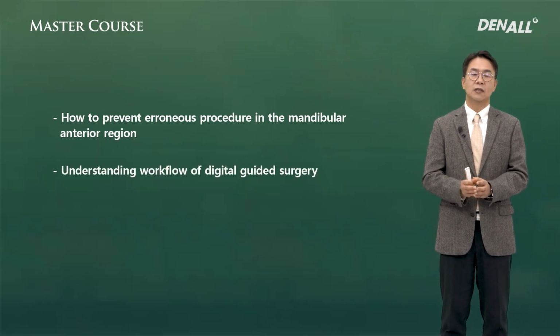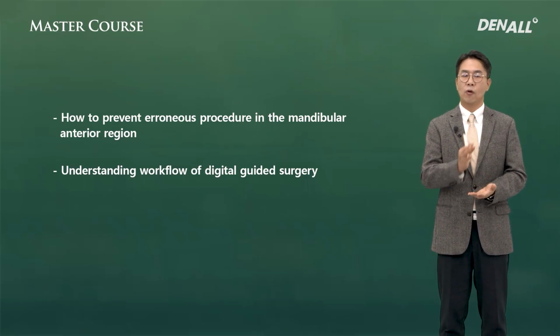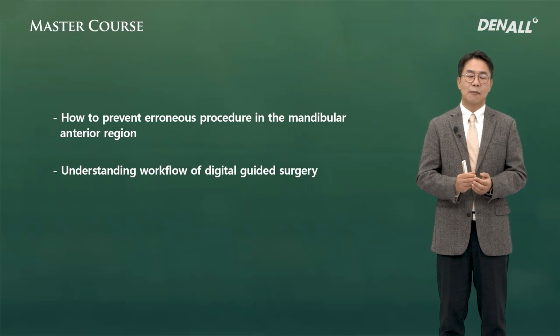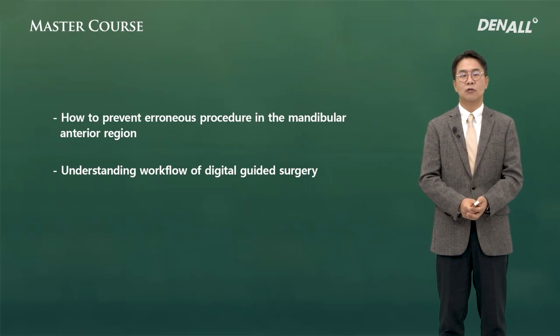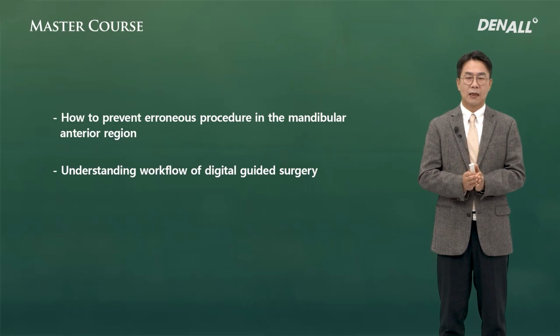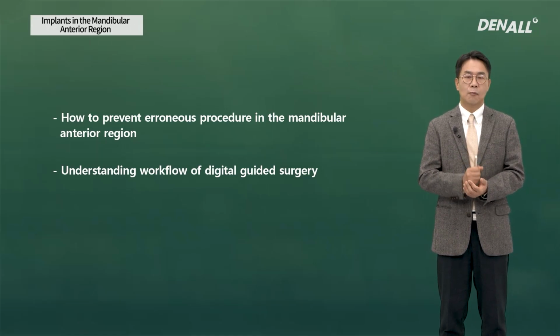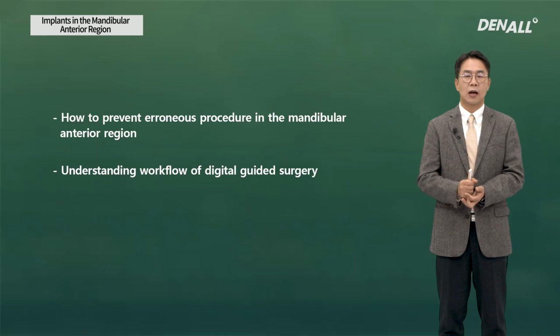For guided surgery, you need to follow the workflow. You need to understand the workflow to determine whether the procedure is for you or not. If you determine that it is for you, you can apply it. If not, you need to get skilled in getting accurate positioning.